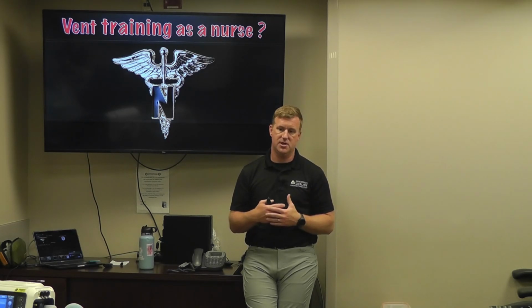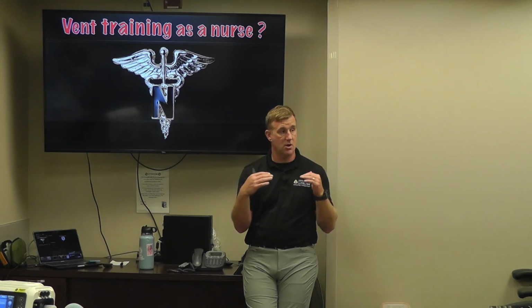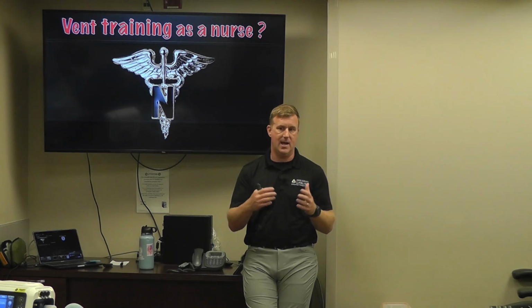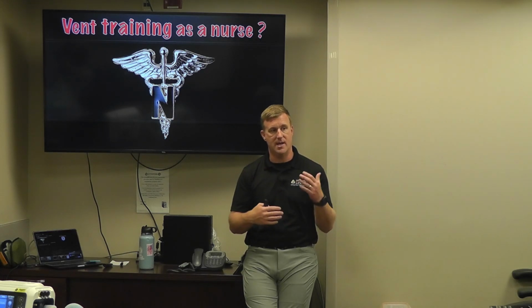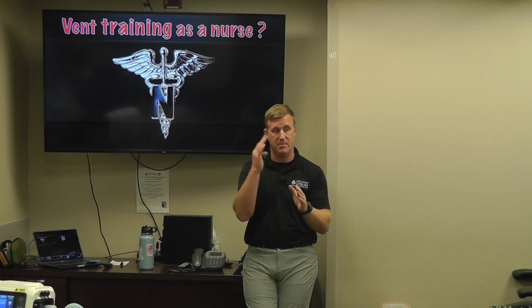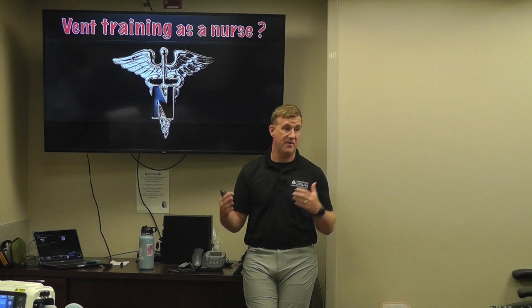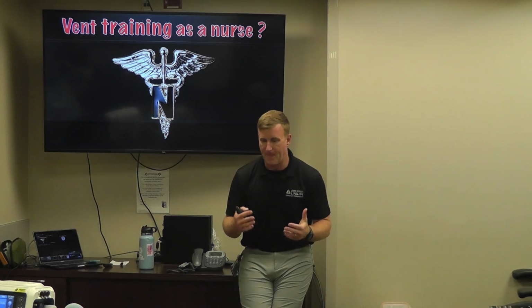All right, mechanical ventilation is very much a game of not necessarily trial and error or a guessing game, but it is very much a game of let's start here and see what we get from our patient and then adjust from there. It's not one size fits all. I can't look at anybody in this room and say, I'm going to put you on this and that's going to be perfect for you. We're looking at what we're getting back from our patient, both from the ventilator and on the monitor.